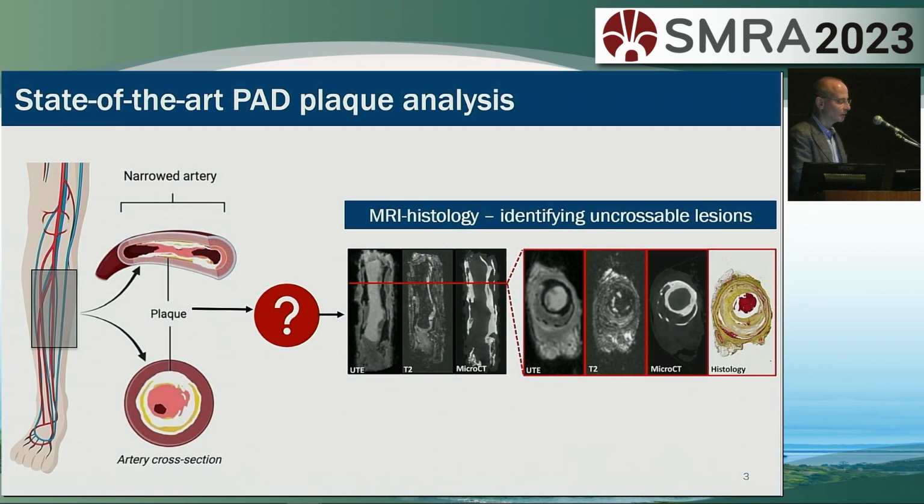At the core of the matter is peripheral arterial disease plaque analysis. And as you all know about that, right? And so what we use MRI for, right? We look at composition. But more specifically here, the interest is really for a particular application, and this is crossability and endovascular treatment, right? So what it gets down to is the plaque hard tissue, soft tissue, right? Very, very easy. So not looking at the complexity, not looking at the whole composition. We had great talks here, the earlier days, carotid plaque composition and so forth, but here's a very well-defined application.